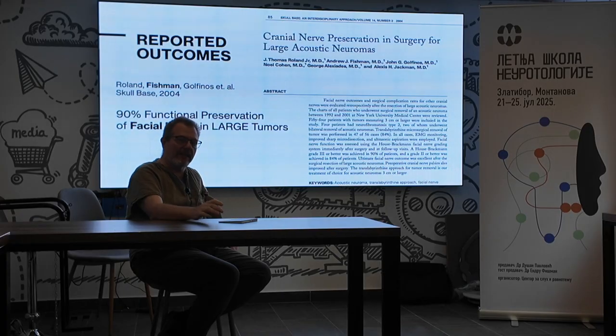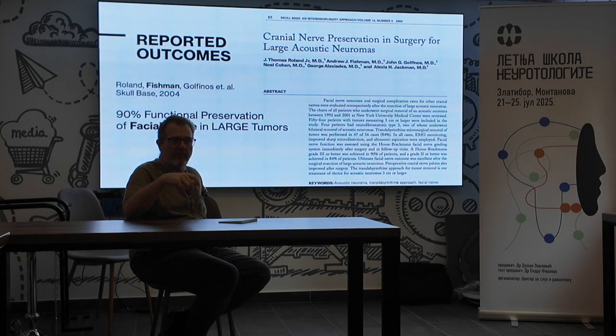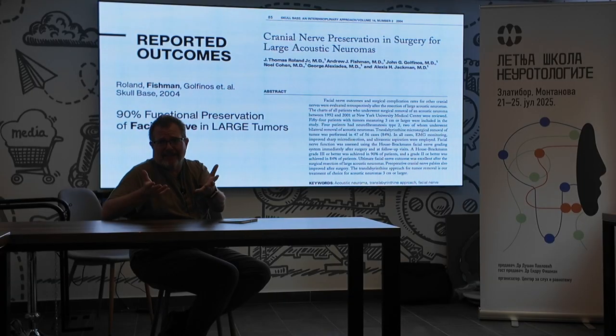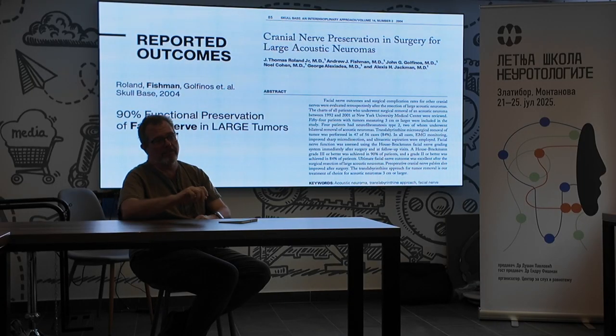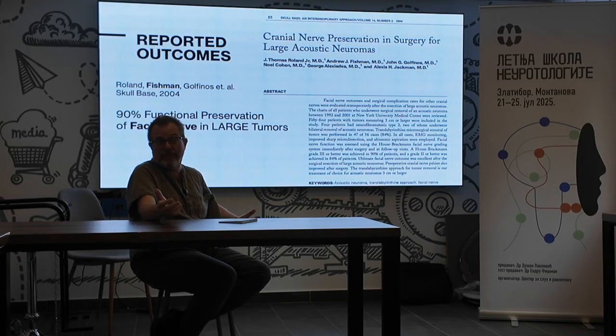Now, what we're beginning to do in my center in Poland is, for medium tumors a little too big to save the hearing, we're doing a translabyrinthectomy, but we're also preserving the cochlear nerve, which is easier to do by taking out the balance canals. You can see it, and putting in a cochlear implant. So now we're also doing hearing preservation, but through an implant.